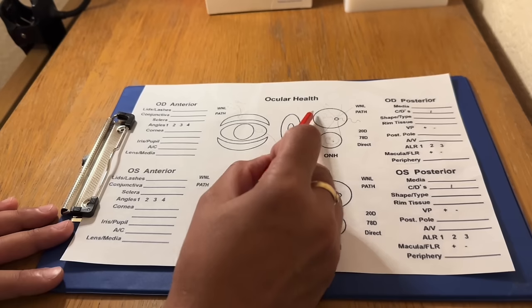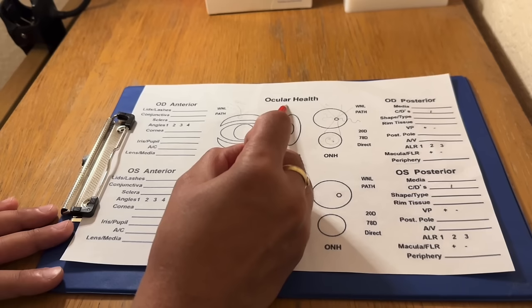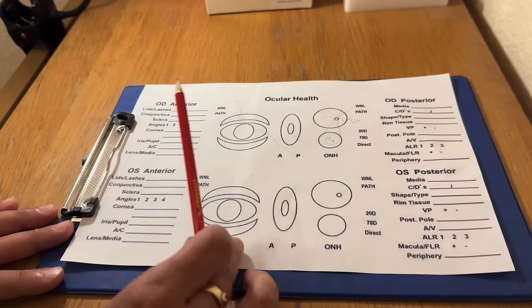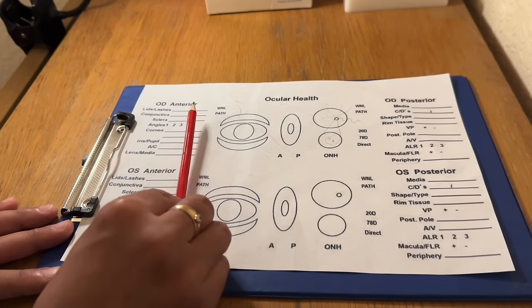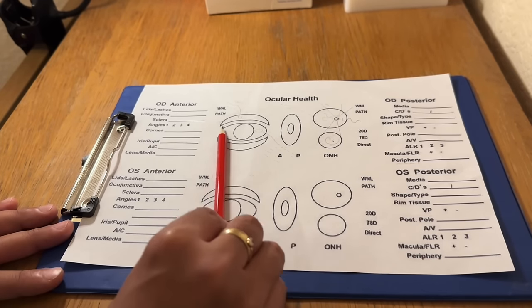So have we seen anything in the peripheral retina? We want to label and describe it. So that's just a brief overview of a template record card. We should always record our results in detail, contemporaneously, with your illustrations well labelled if possible.